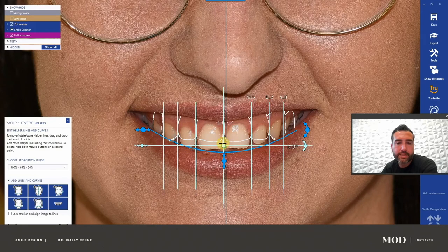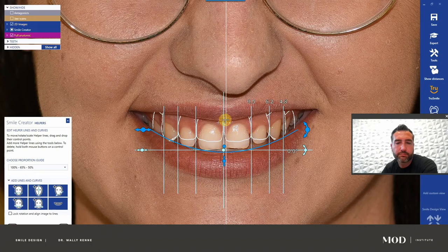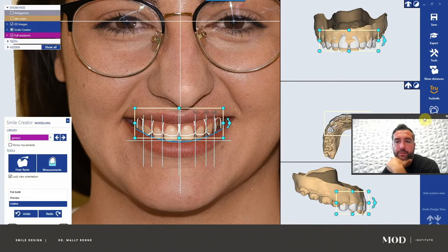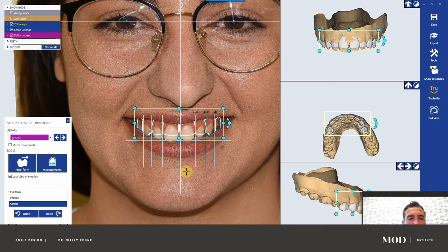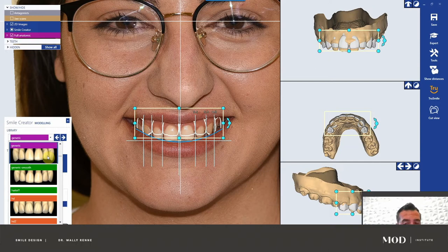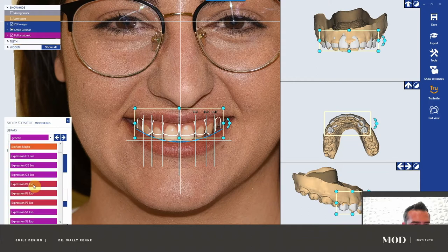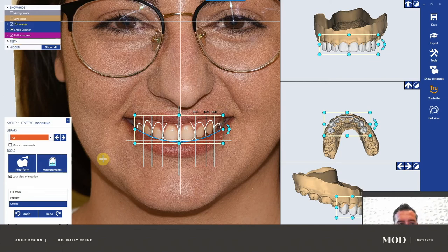I accidentally had the proportion ladder up here when it should have been down here — not a big deal, we can move it in the next stage. This is when you want to pick your library. Move this kind of out of the way. You have all these different libraries you could choose from depending on what you've purchased — there are a lot of third parties you could purchase ExoCAD libraries from. The ones you probably have are the generic HD ExoCAD PlanCAD Premium library. Let's go to HD.